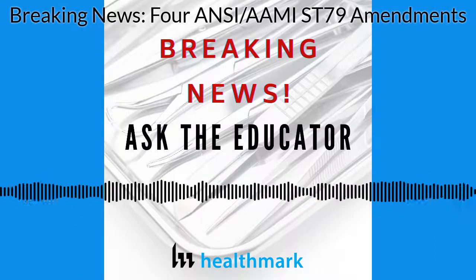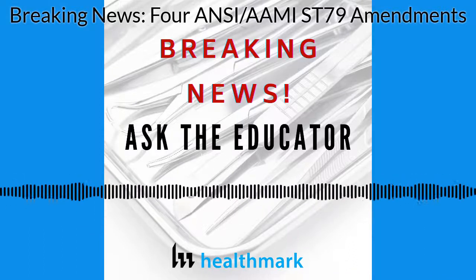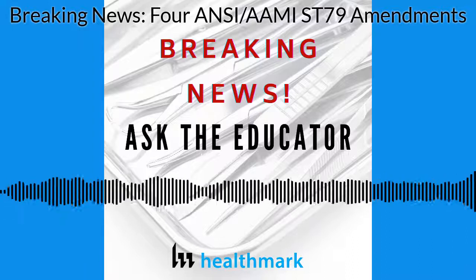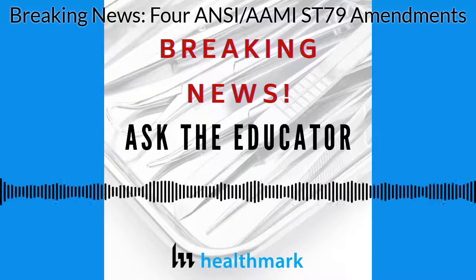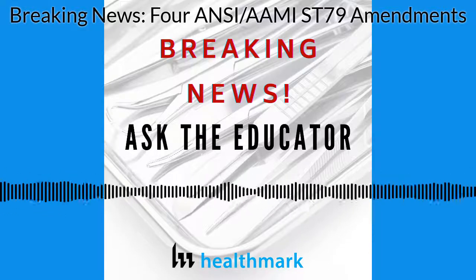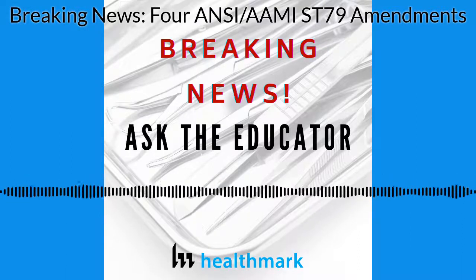3.2.1.1. I know many of you have been looking for further guidance and specifics regarding environmental cleaning in the sterile processing department, and now you have it. You will see items that need to be cleaned on a schedule, whether it is daily, weekly, or even monthly. And you will see recommendations for documenting these cleaning procedures.